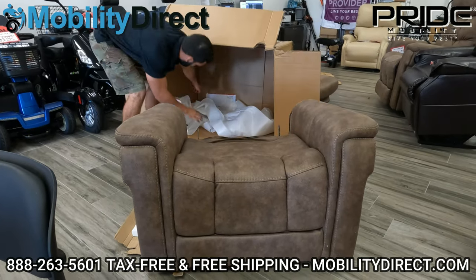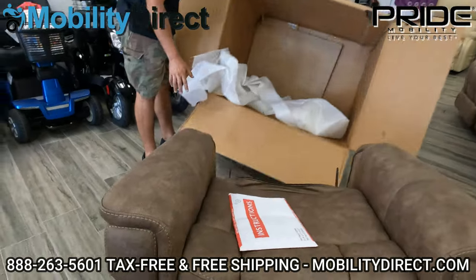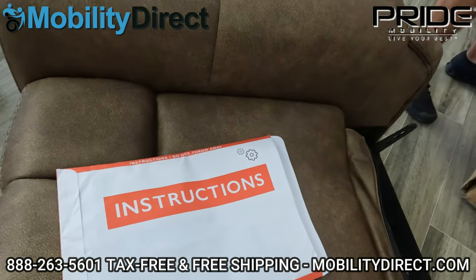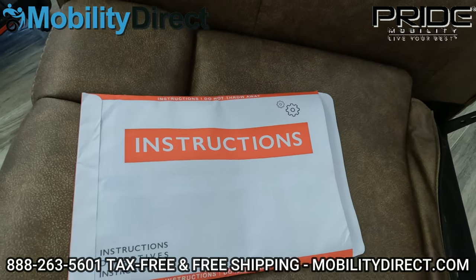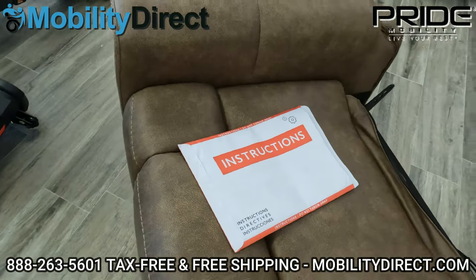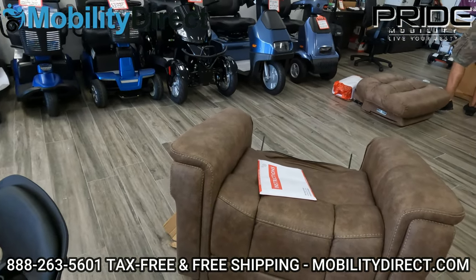The user manual is down here. It's very important that you read the user manual in its entirety — it's going to have some instructions on how to assemble this chair as well. But if you just follow along with this video, you should have your chair up and running in no time.